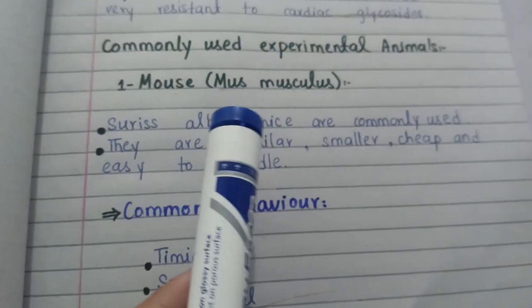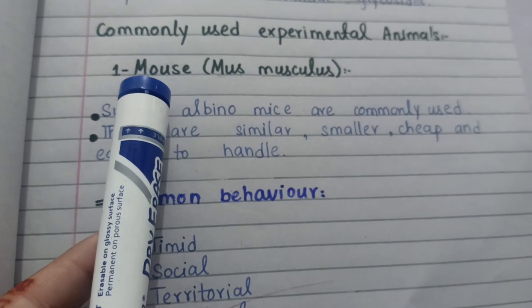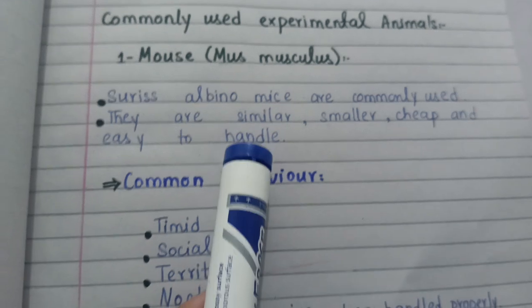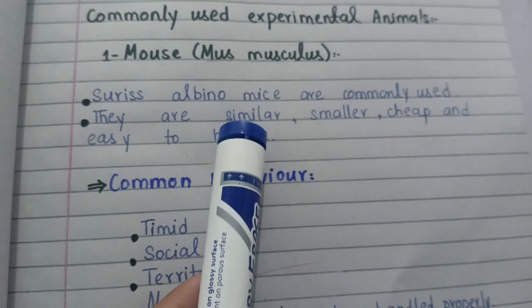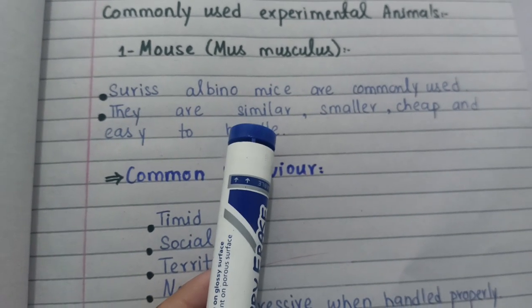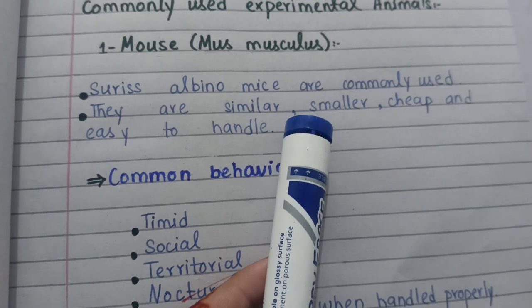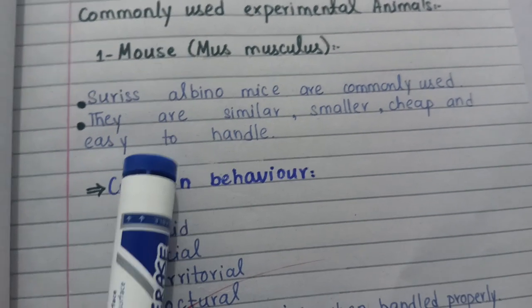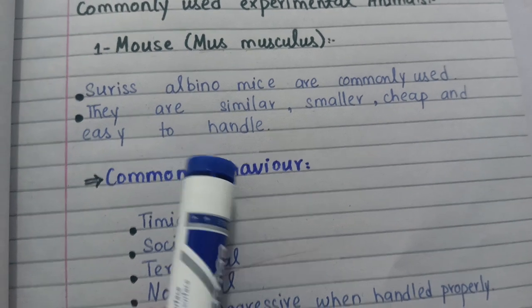Now we are discussing some animals that are mostly used. First is the mouse. This is the scientific name of the mouse. Why are they used? Because they have a very similar system to the human. They have a very small size. They are very cheap, easily available in our environment, and they are easy to handle. That's why we use them.